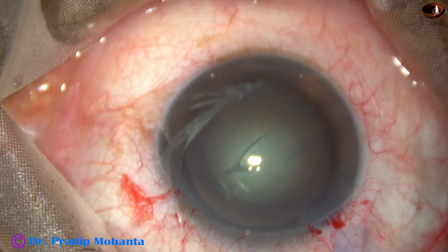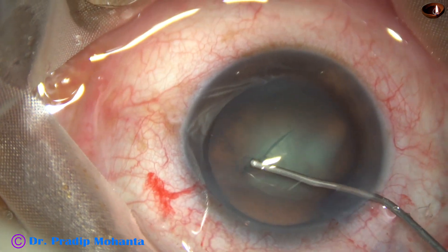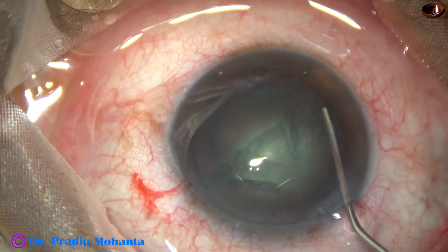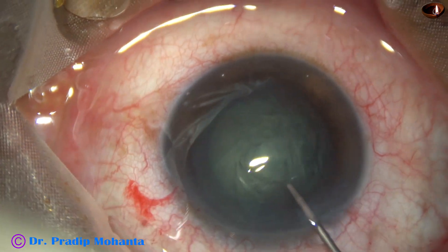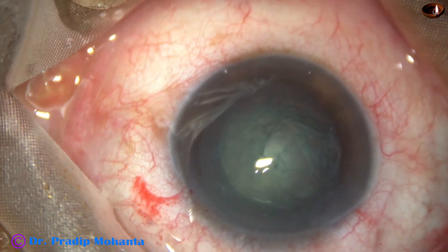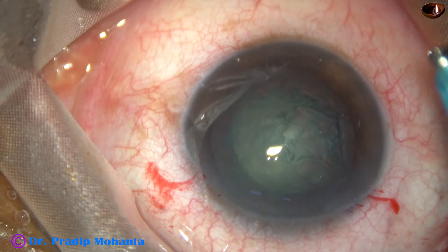Now hydro-viscodissection is done with a 27-gauge cannula. The nucleus is stabbed and rotated. Again viscoelastic is used to fill up the anterior chamber, and then the phaco needle is introduced into the anterior chamber.